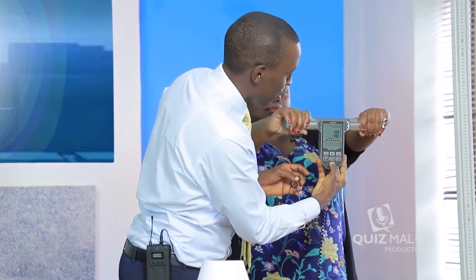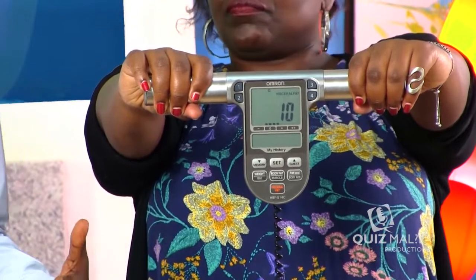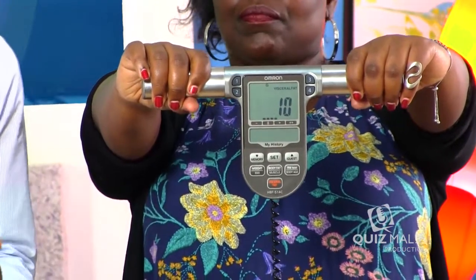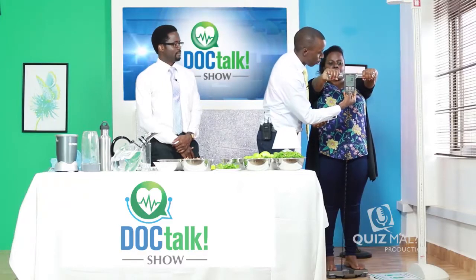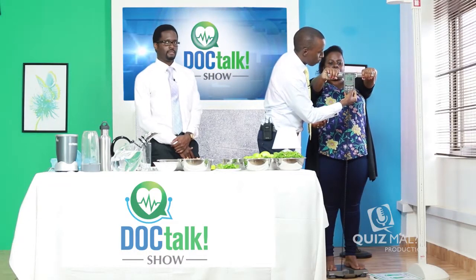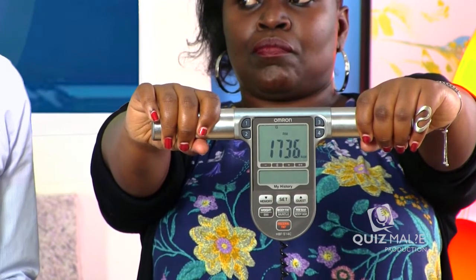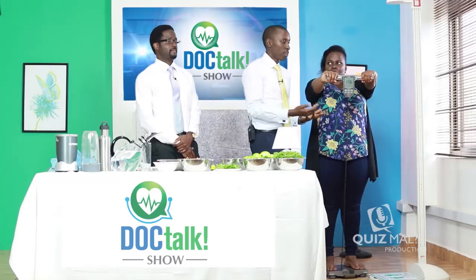There is something called visceral fat, which measures the fat around the organs, especially the belly. And this number is 10, and the normal range should be 1 to 9. So we are going to try and get that lower. The metabolic rate, her metabolic rate today is 1,736. That's how much energy her body spends at rest.